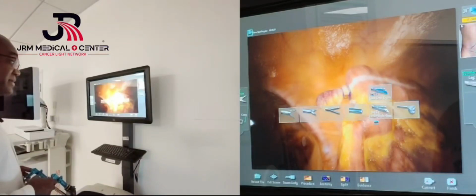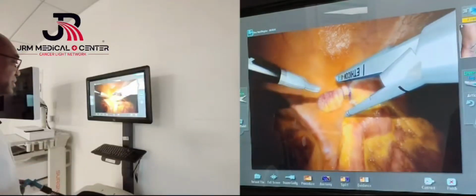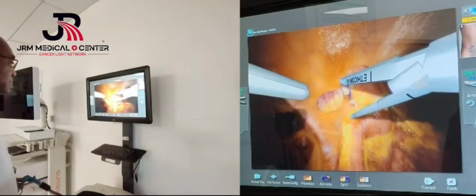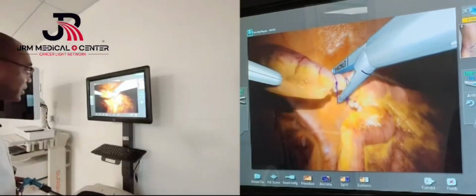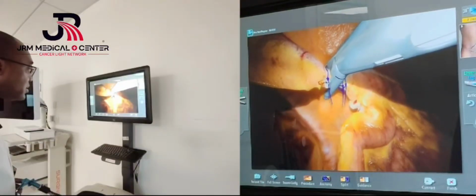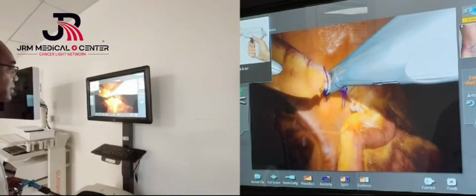In this case, since we have all of these at our disposal, let's explore. We could just use a linear cutter to separate the appendix. Now I'm going to gently pick up the appendix and place my linear cutter between the loops and make sure. Okay, that's done.